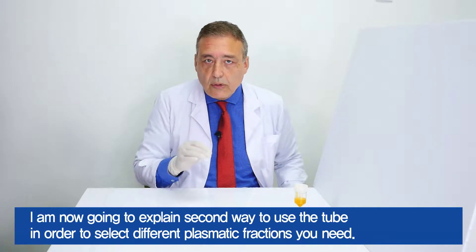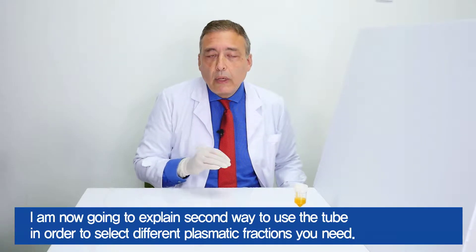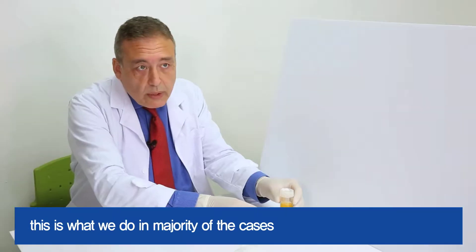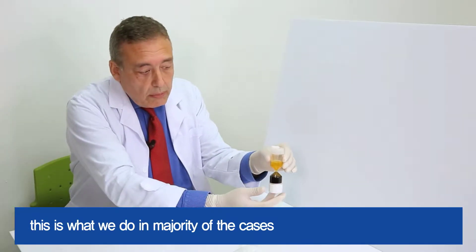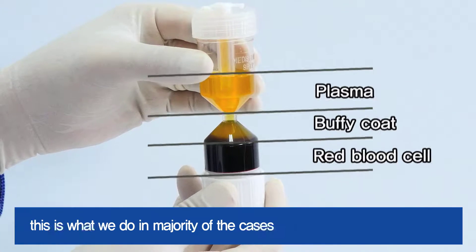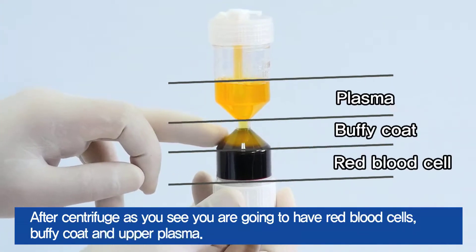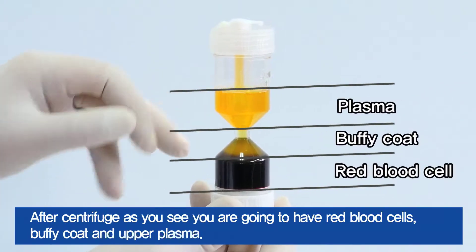I'm now going to explain the second way to use the tube in order to select different plasmatic fractions you need. This is what we do in the majority of cases. After centrifuge, as you see, you're going to have the red blood cells, the buffy coat, and the upper plasma.